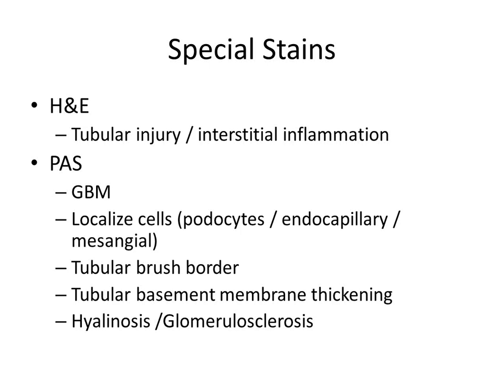For H&E, I really think it's probably only good for assessing tubular injury and interstitial inflammation. I think it is almost pointless for looking at glomeruli. So if you have a dog with proteinuria or some other evidence of glomerular disease, maybe red blood cell casts in the urine, and you're only evaluating with H&E, I think you're doing a disservice to that patient. You should at least do my favorite stain, which is the PAS. And don't do it just because it's my favorite stain. I just had to say my favorite stain there. The PAS is going to help you evaluate the glomerular basement membrane.